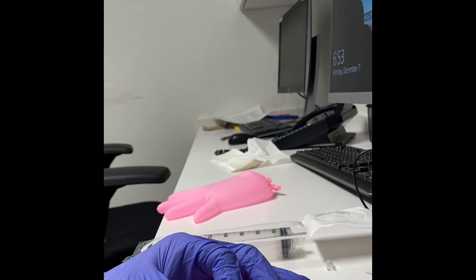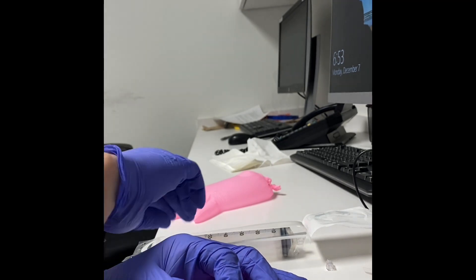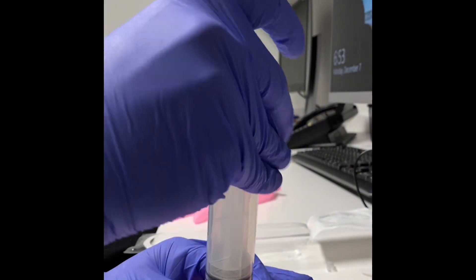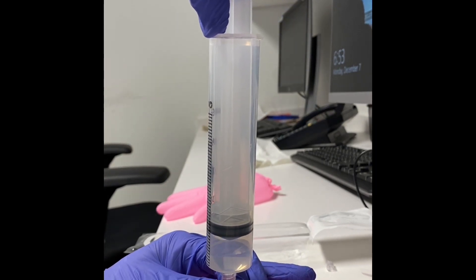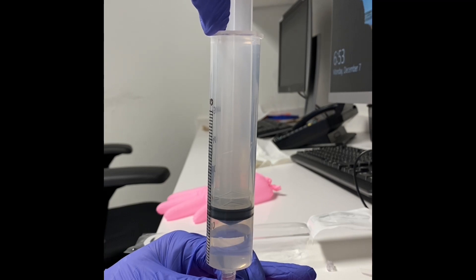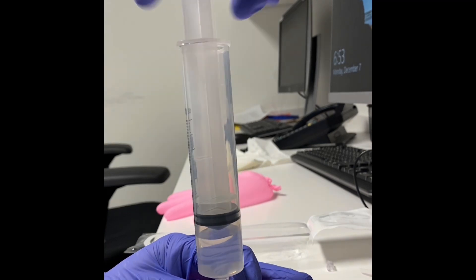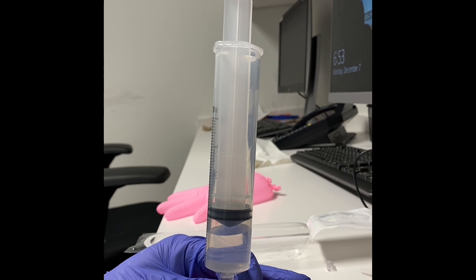Now in a patient with ascites, there will be ascites fluid streaming out of here, so you want to rather quickly hook up your 60cc syringe to withdraw your sample. We keep going up to 50 or 60cc to get enough for cultures, cell counts, and things like that.